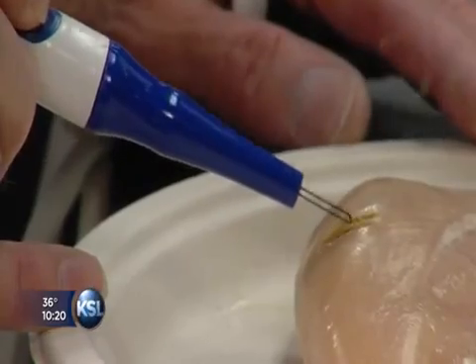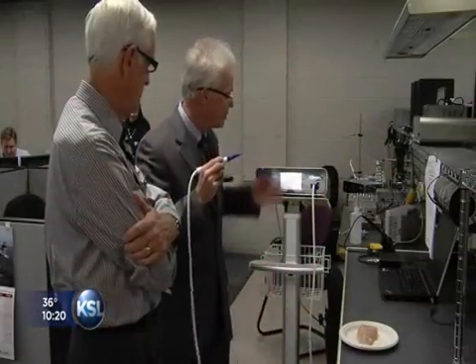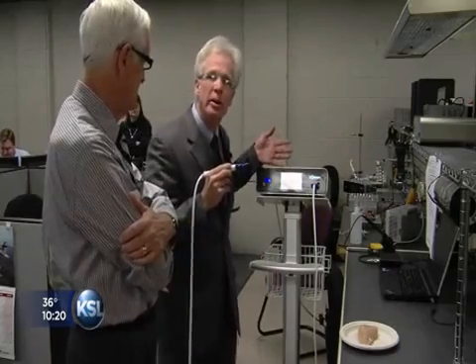The device cauterizes as it cuts and prevents bleeding. That's what Dr. Kim Manwaring wanted when he first kicked around the idea. I met Dr. Manwaring in a garage where he showed me a ham radio with a small piece of wire, and he showed me how we could heat that piece of wire, and we talked together about the potential applications for that technology.